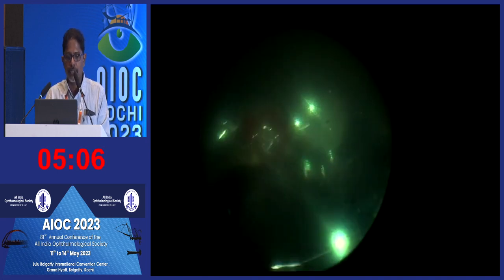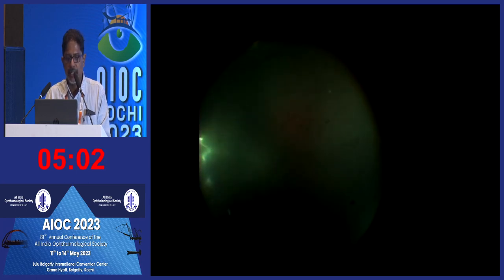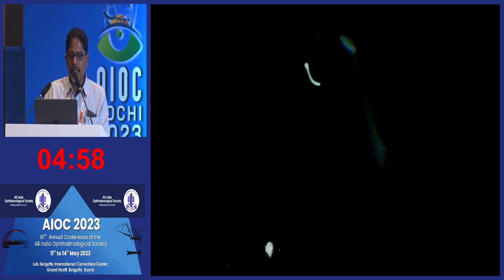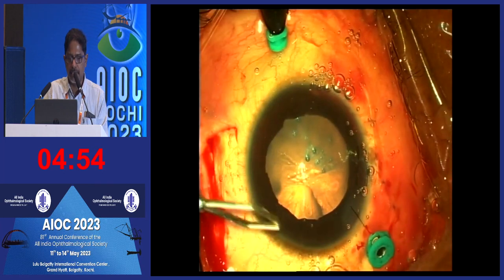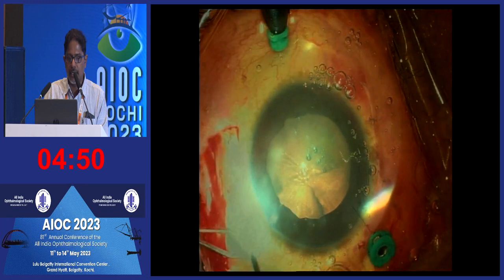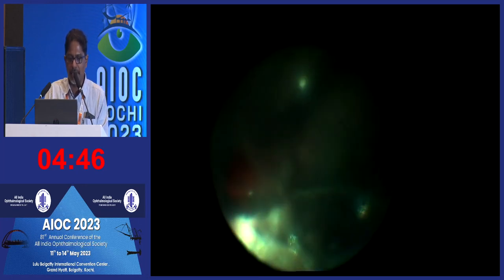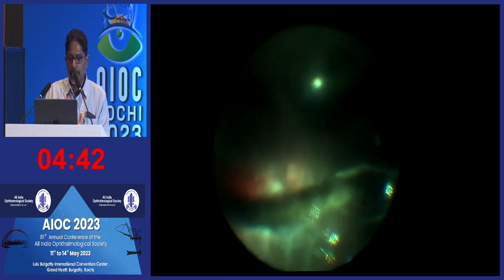To prevent it from falling down and causing further retinal injury, because the nasal retina is already injured, I am doing a fluid exchange and injecting oil into the vitreous cavity. My logic is that oil is more viscous and will keep the foreign body in place even if my forceps slips off. This is the Machemer two-prong foreign body forceps, because it's a large foreign body and routine forceps do not work well. That is the forceps in place now.